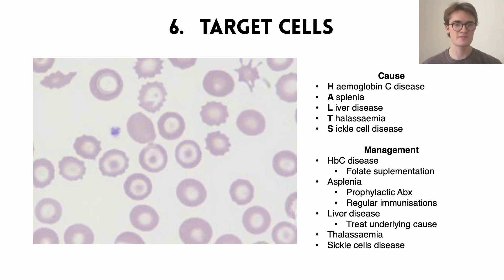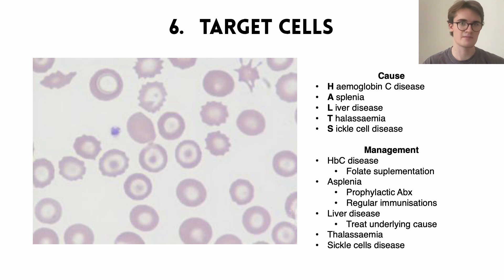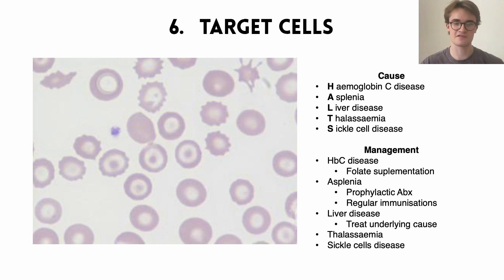The next blood smear to discuss is target cells. On first glance the smear looks quite normal, with some circular red blood cells with a pale center. But in the middle of the screen we can see abnormal cells that, alongside that pale center, have a second dark spot in the center — making them look like an archer's target. This is abnormal and has five main causes remembered by the mnemonic HALTS: H-A-L-T-S.